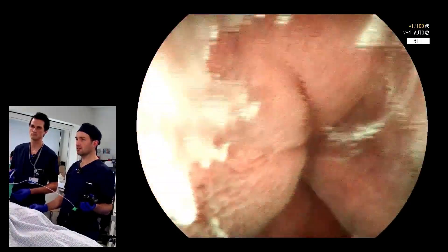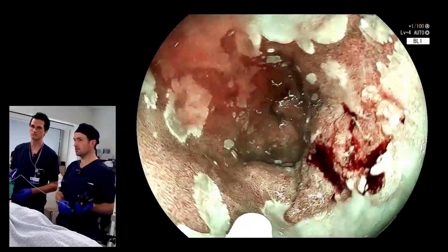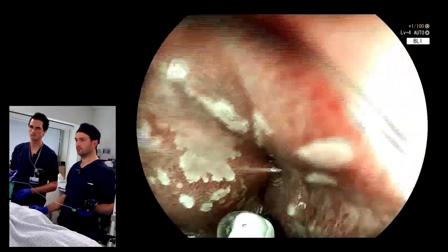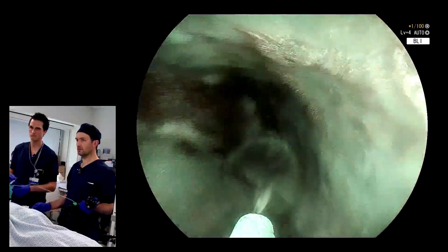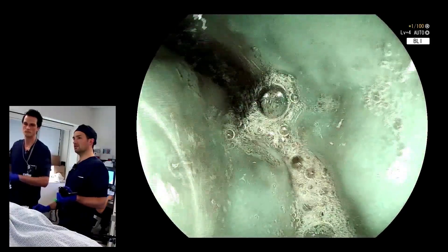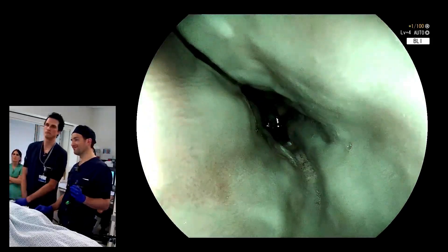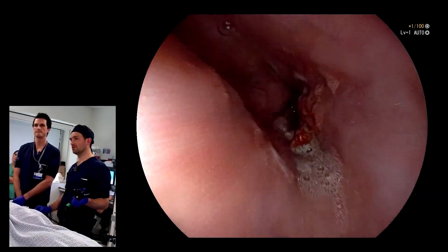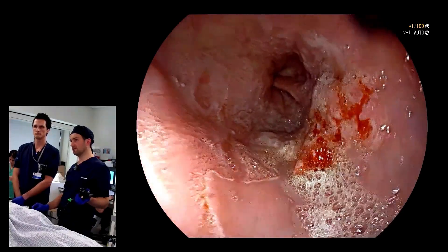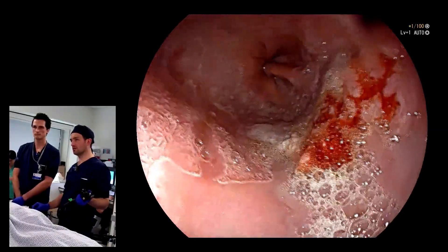So, another way to delineate a bit more the margin of the thing you want to resect, or at least characterize to see how much it is, is to put this. We just take a bit of gas out of the lumen and let's go. Here we go. I'll do the whole thing. Now, we just suction the lumen closed so we get full coating. There's a little bit of bubbling there to start with. If it's not bleeding, the combination of this and BLI is fantastic, but I just expect that given the bleeding, we're going to have to use white light. You immediately — this is the blood from before — but within about 20 seconds or so, we should see loss of acetyl whitening of the parts which are dysplastic.